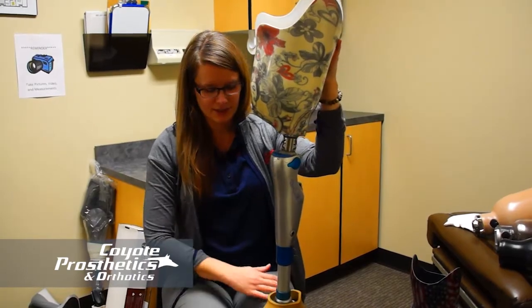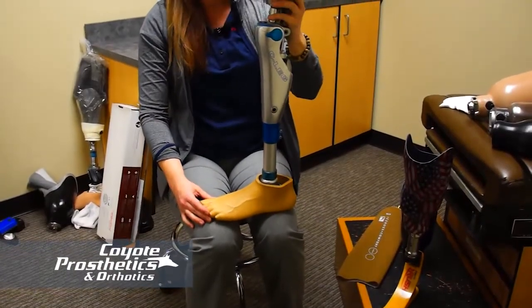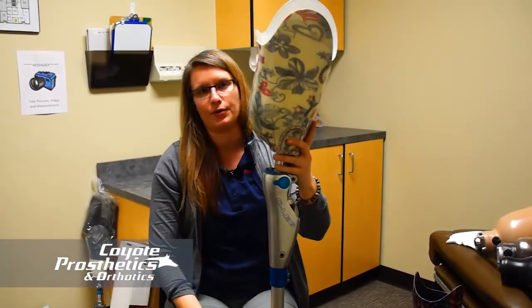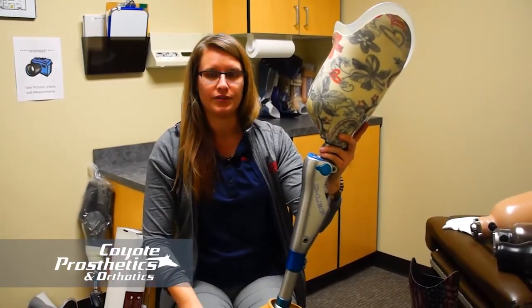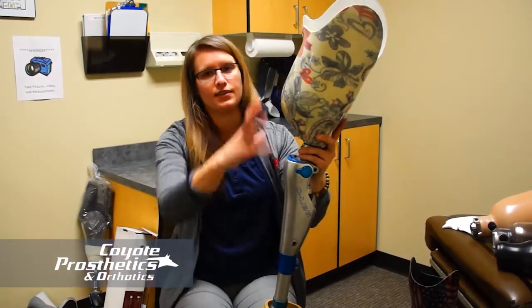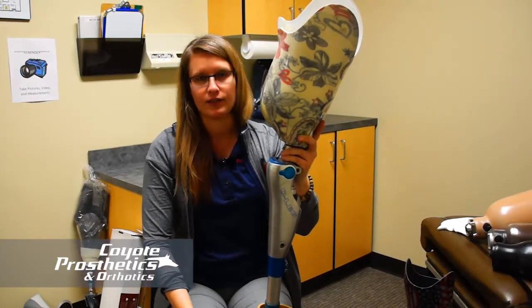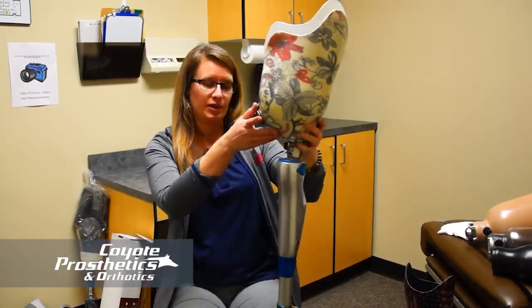And the reason for that is that these feet are made to wear with a shoe. And if you have too high of a heel height, it'll change the whole angle of your leg and how you're walking. And same thing if the angle of your shoe is too low, it'll change everything above it. So you want to just be really careful that you're not changing your heel height with your shoe, because that can throw everything off a little bit.